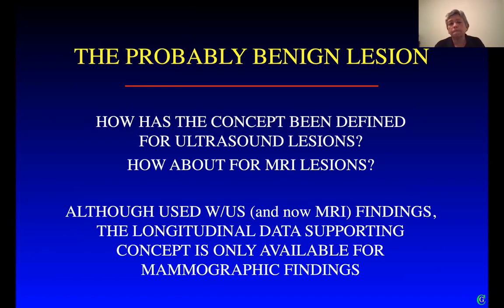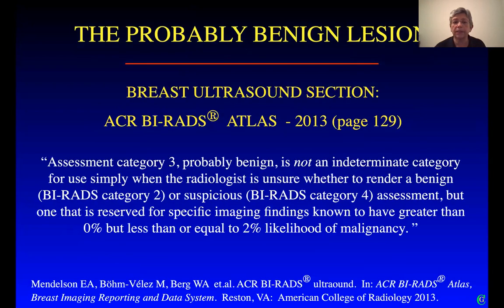Now, what about the concept for ultrasound studies? And as I said, I'm not going to say anything about MRI lesions. We routinely use it with ultrasound, but we need to recognize that the longitudinal data in support of this concept is only available for mammographic studies.